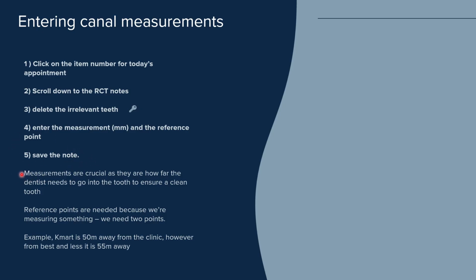Okay, so measurements are crucial as they tell us how far the dentist needs to go into the tooth to ensure a clean tooth. Reference points are needed because we're measuring something. We need 2 points. So if you draw a point here and a point here, you need that to measure. Okay, if I just give you a point here, how long is that? From where? You need to know from where.